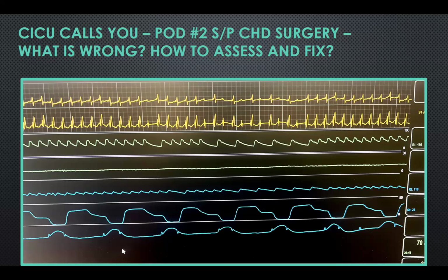Okay, so now you're at 20, you're capturing. How would you determine the threshold? You could just start to slowly peel back and see where you elicit a similar... Yeah, finding where you're missing beats. That's right. And in fact, what we determined the next morning was that the threshold had gone up slightly.